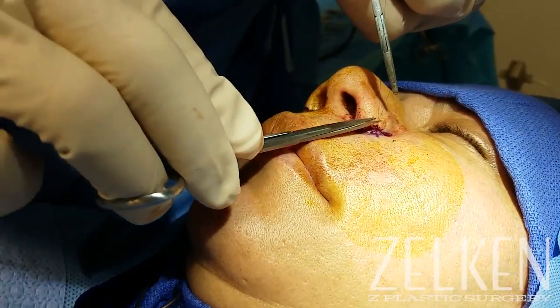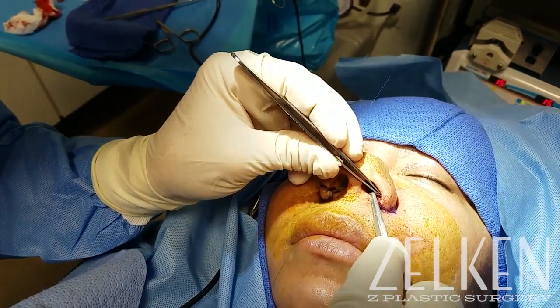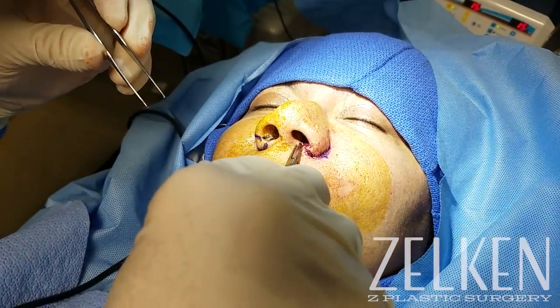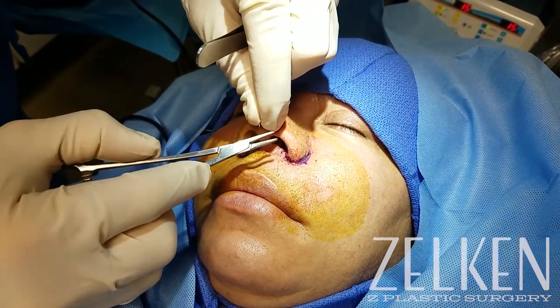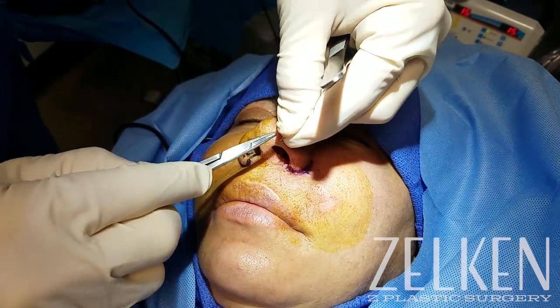I don't have an assistant in this procedure. If I had an assistant, it would be a lot easier, but it is certainly not necessary. Other people ask about the use of chromic sutures inside the nostril. I will go back after this video and place 5-0 fast-absorbing gut sutures in the mucosal portion of the closure. However, for the sake of the video, you're going to see the cutaneous prolene closure.